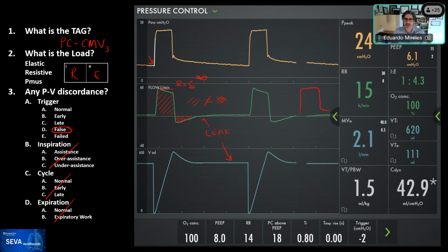And the second part I would say is that in a patient like this, setting the inspiratory time, for example, can be tricky, right? Because you're trying to pressurize a system. There is no way to know if the patient is getting enough to pressurize the system except the physical exam, because you have to see that the chest stops expanding. Any comments there, Rob? No, I think that's exactly right.